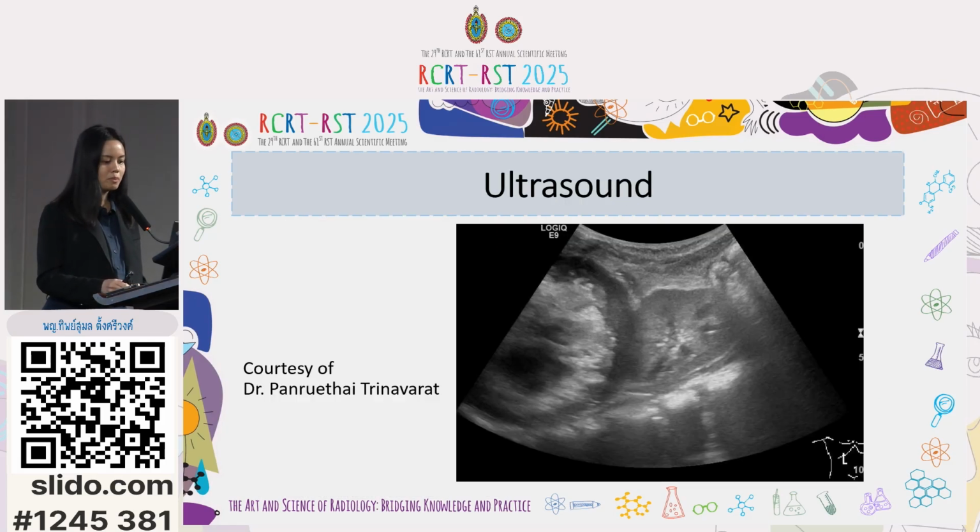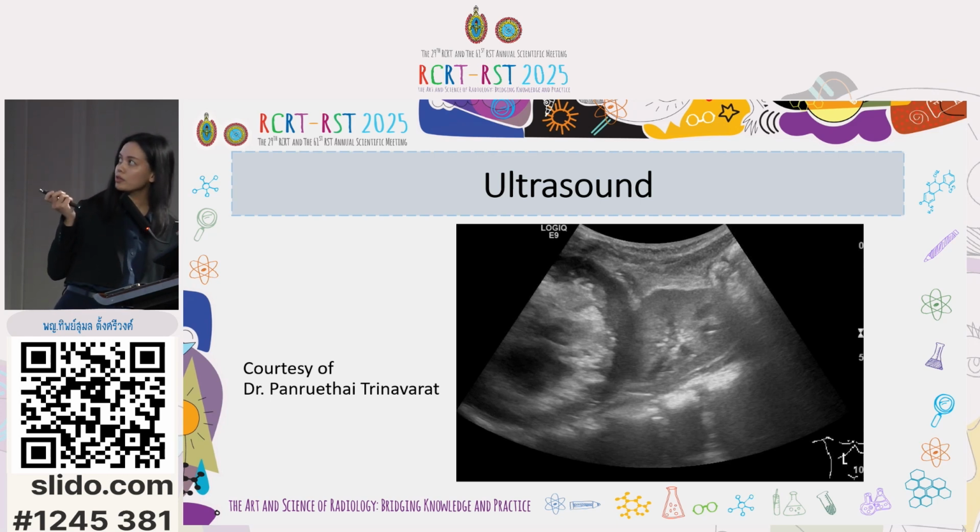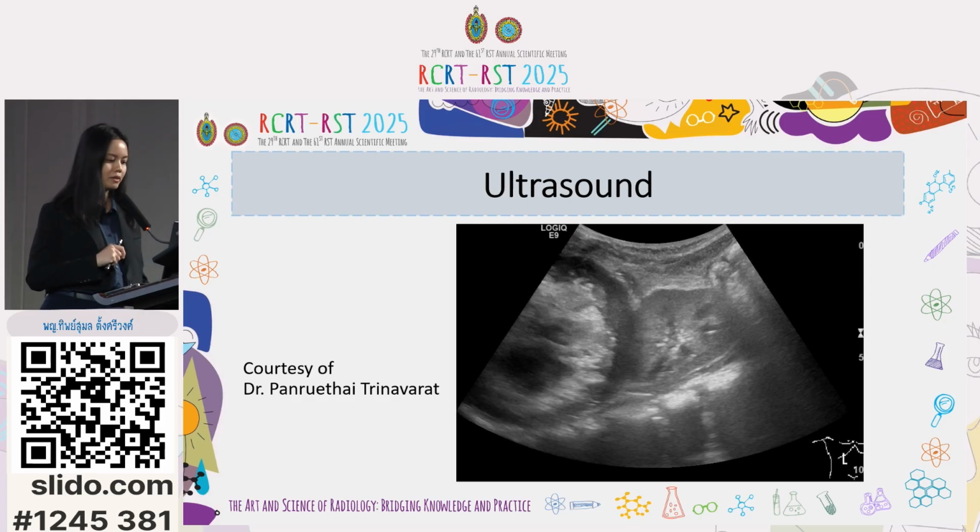Ultrasound helps determine the size, location, and characteristics of the tumors, especially in the abdomen, and is useful for guiding further investigation as well. This sonographic image shows a large calcified soft tissue mass in the right suprarenal region, a typical finding of neuroblastoma.